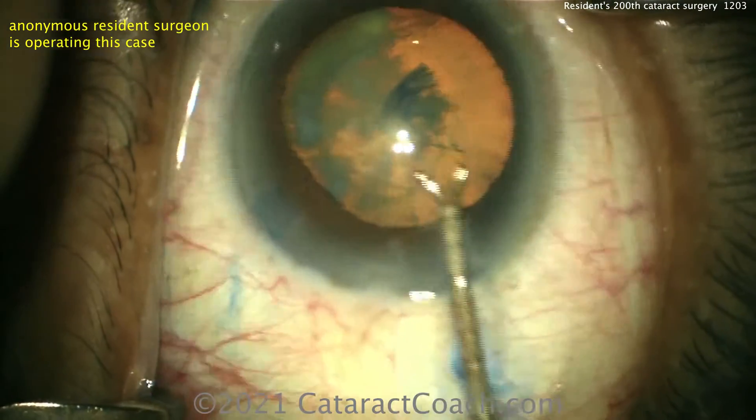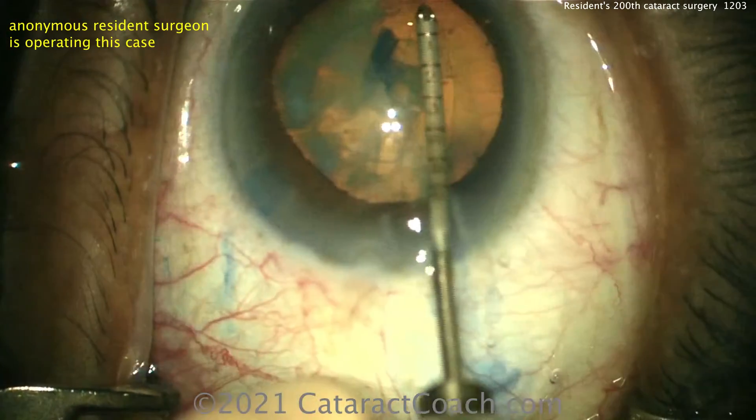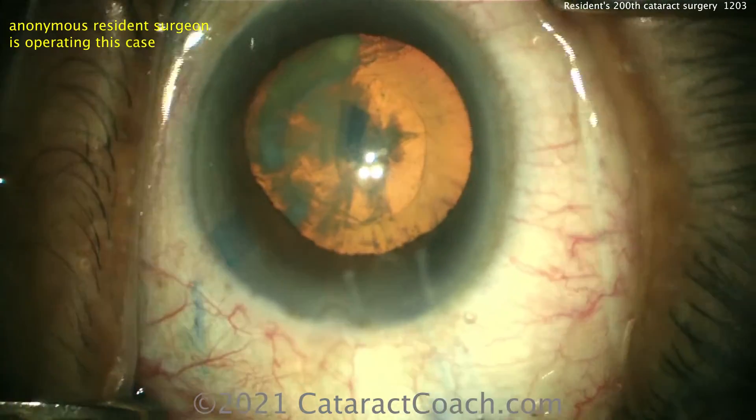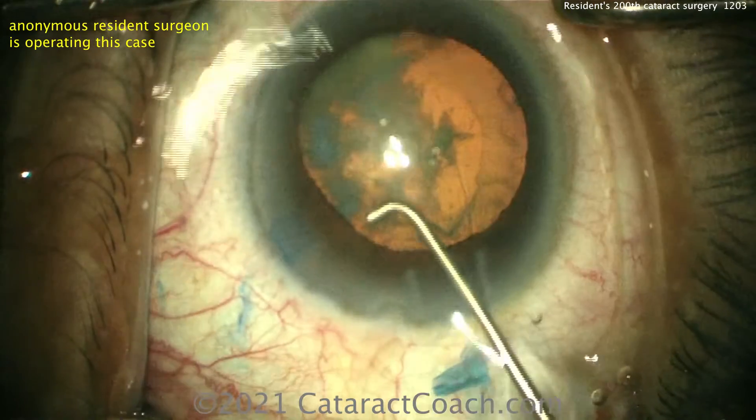Now here's where you're making the rhexis too small — no, no, no, keep it bigger, keep it bigger. Now it's a little small, and you can see it's a little eccentric too. That's probably more like four and a half millimeters rather than five — it's going to make things a little more challenging.